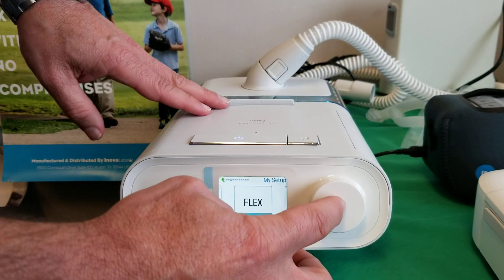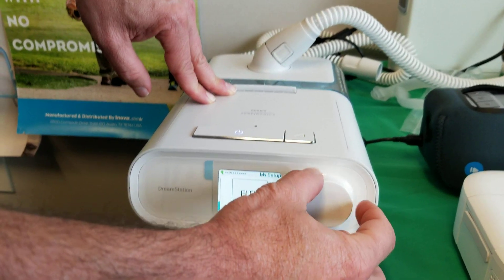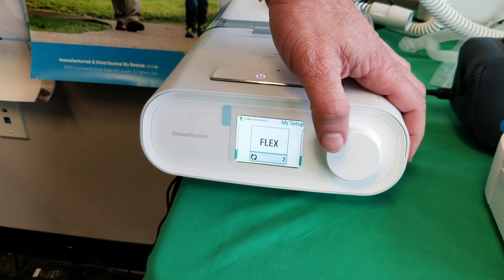Three settings in flex, three being the most pressure relief. Usually we start this at two. It definitely prescribes this on occasion as well. One, two, or three is your setting.